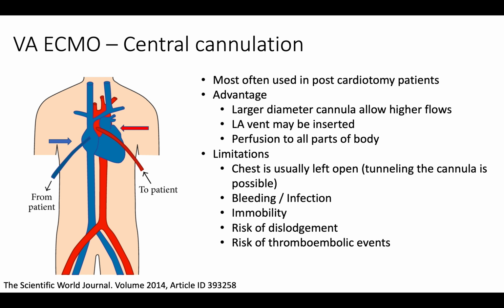When more blood is sucked into ECMO circuit, there will be less circulating through the heart, reducing the myocardial oxygen demand. In other circumstances, such as sepsis, where there may be vasoplegia, higher than physiological levels of ECMO flow may be required to maintain perfusion pressure. Bigger cannulas will make venous drainage easier and reduce the negative pressure that the ECMO pump has to apply for drainage. This will reduce turbulence and hemolysis at the venous cannula.